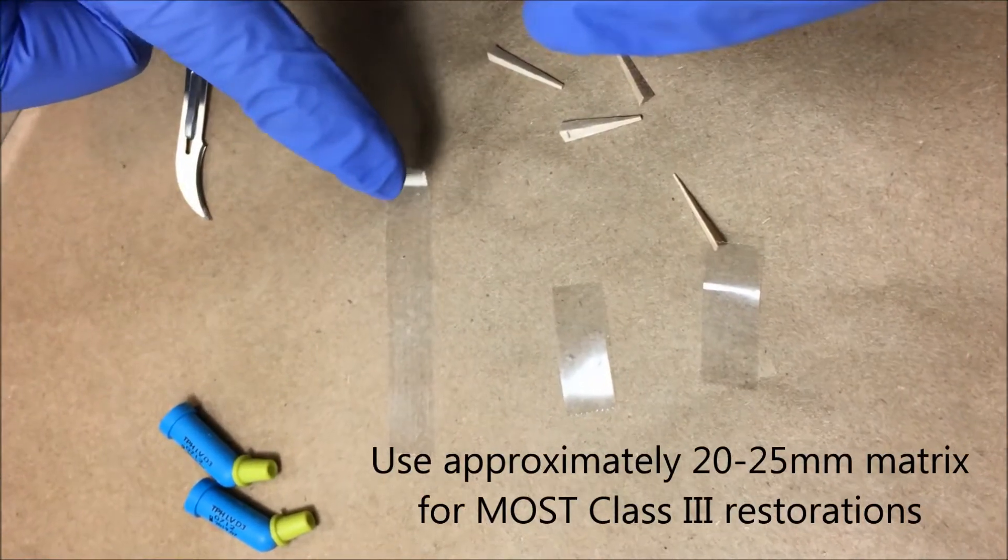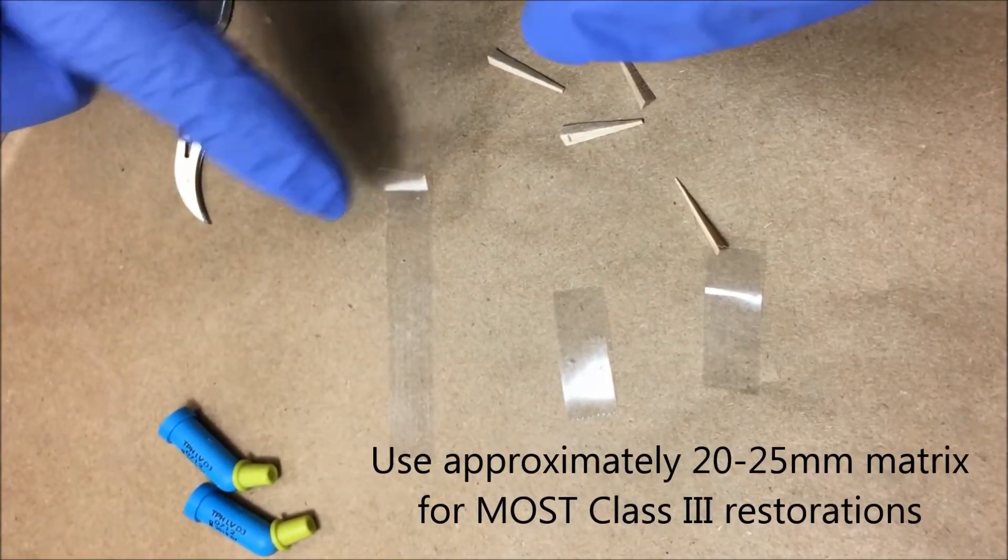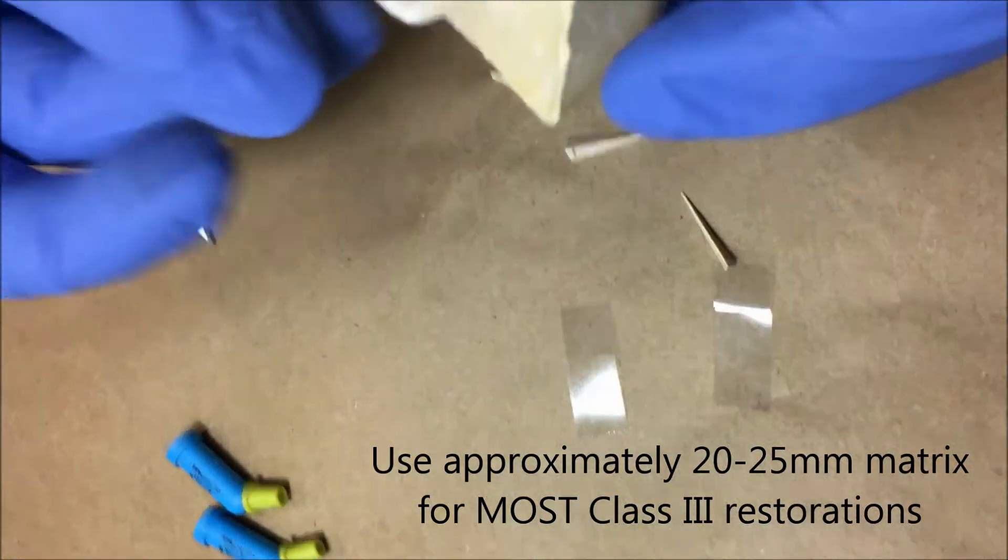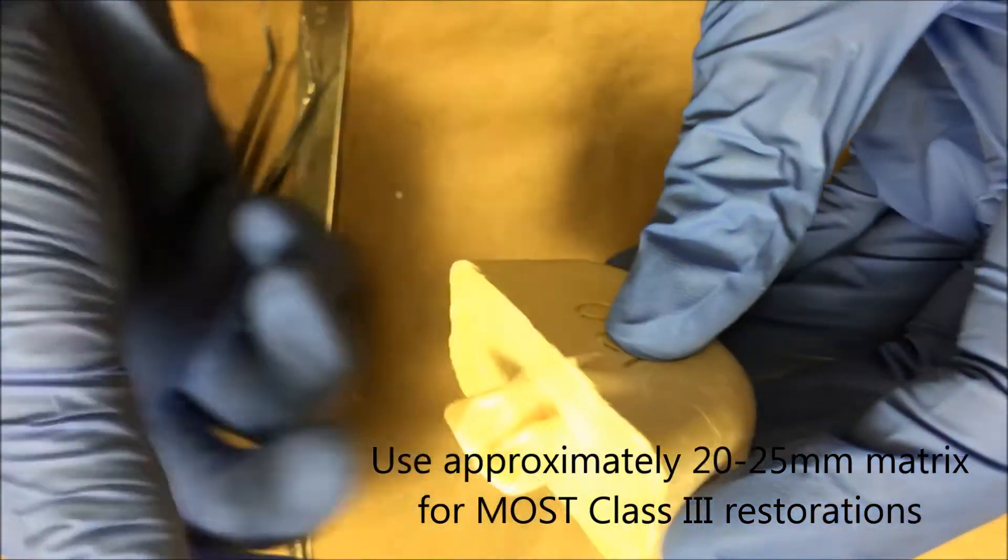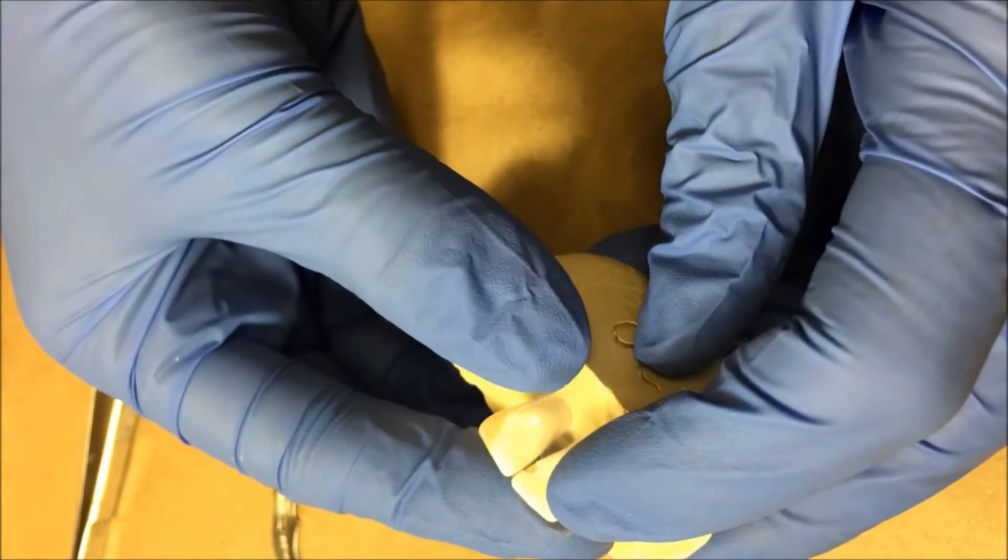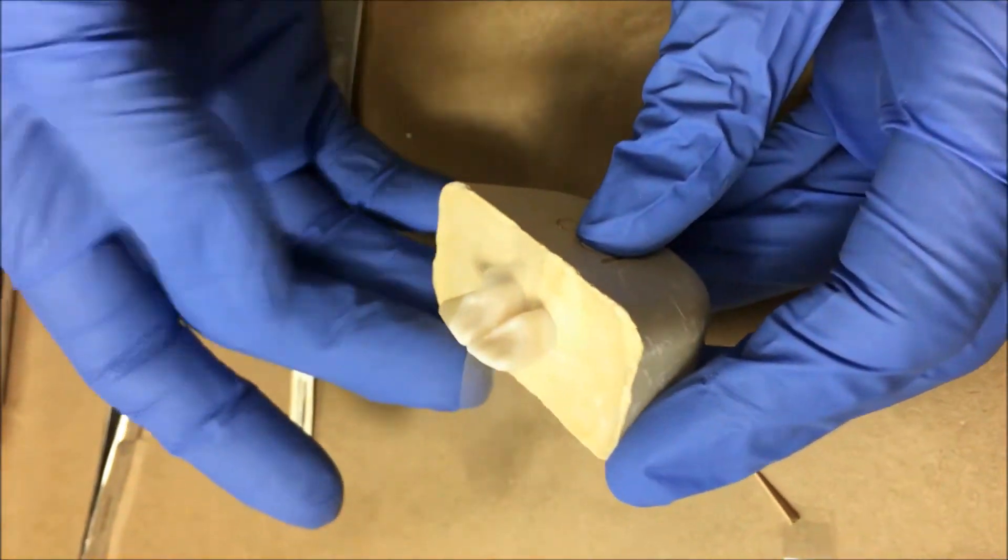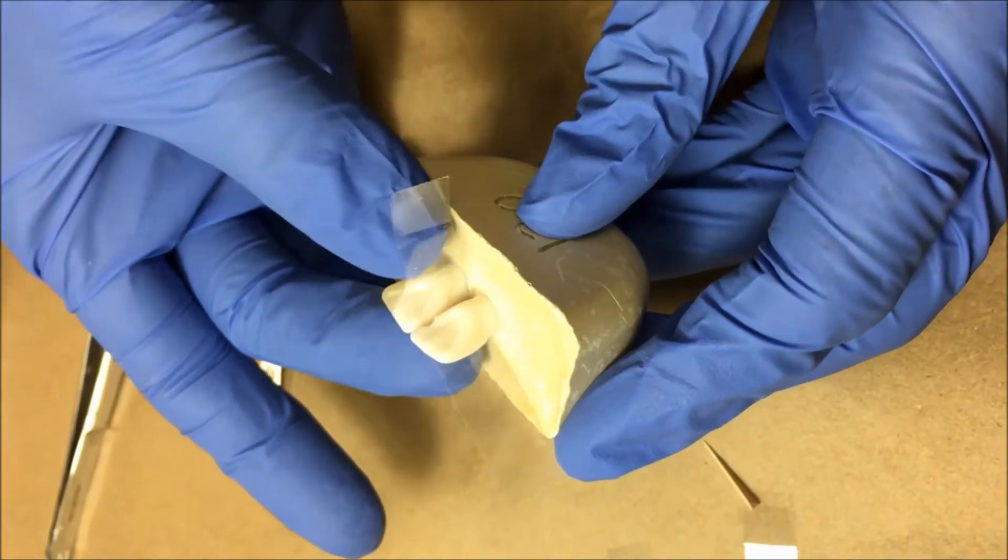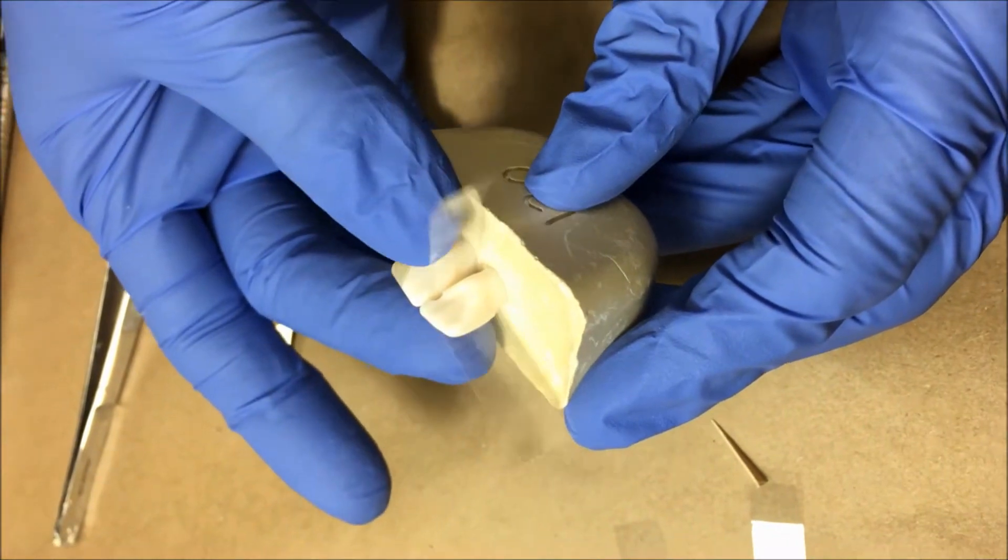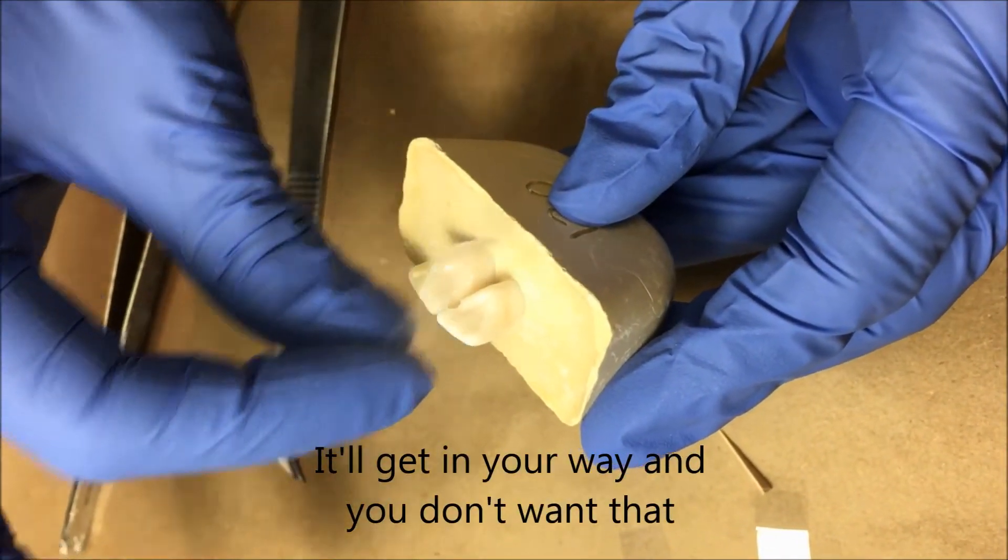This one's too long partly because it's waste but another reason it's too long is if you actually were to wrap this into this area, look at how much extra you have. You don't need to wrap this tooth three times around. If this is on a real patient this is sticking out, catching on their lip, catching on the rubber dam. It's just in your way for the most part.